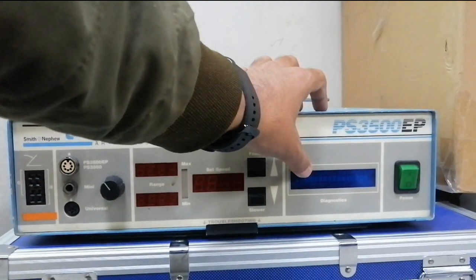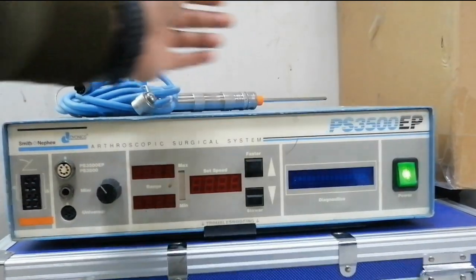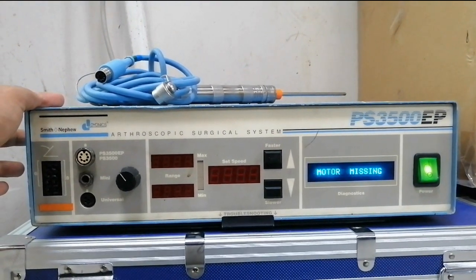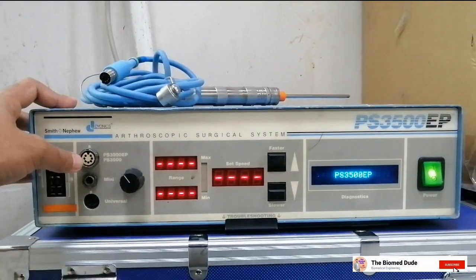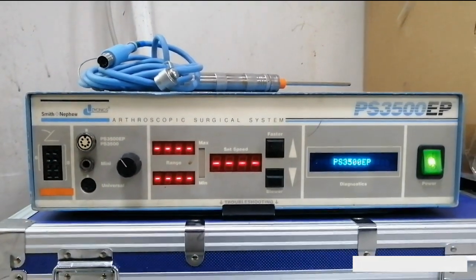Here is the main screen where the functions of this unit are displayed, and here is the on/off button. When the machine is on, it shows the indication for foot controller and handpiece. Select the handpiece as per our procedure and connect it to the machine, along with the foot switch connection for control purposes.